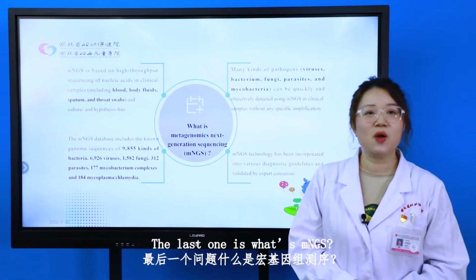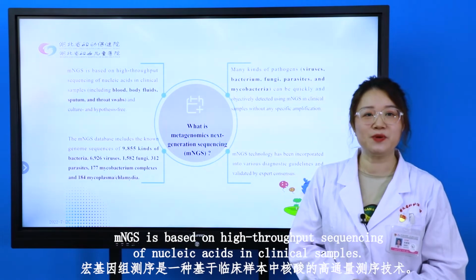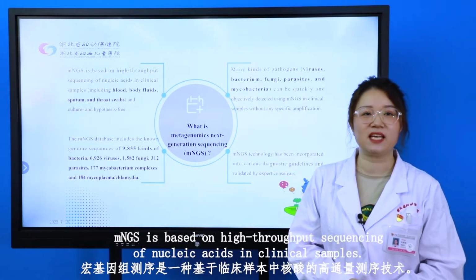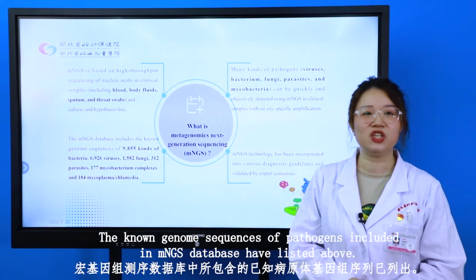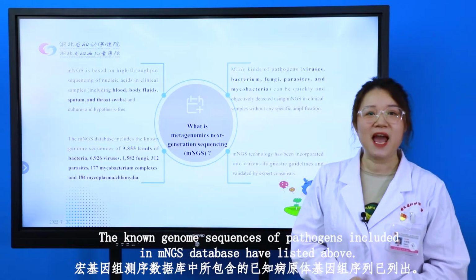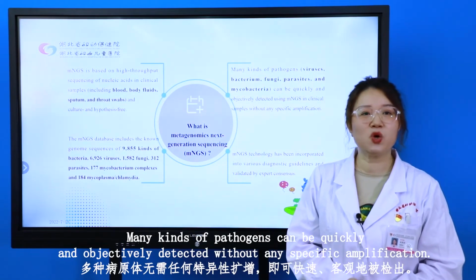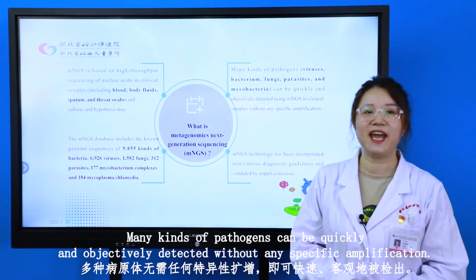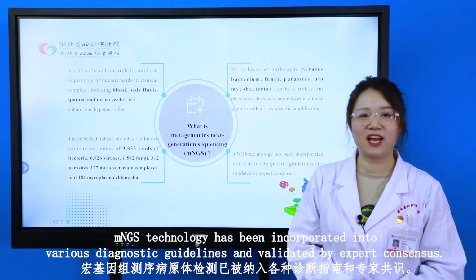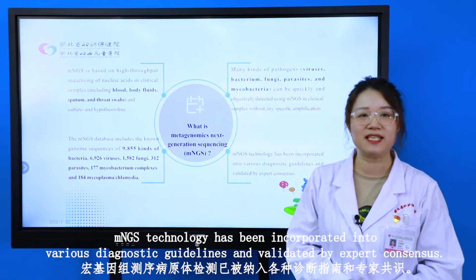The next one is, what is mNGS? mNGS is based on high-throughput sequencing of nucleic acids in clinical samples. The known genome sequences of pathogens included in the mNGS database are listed above. Many kinds of pathogens can be quickly and objectively detected without any specific amplification. mNGS technology has been incorporated into various diagnostic guidelines and validated by expert consensus.